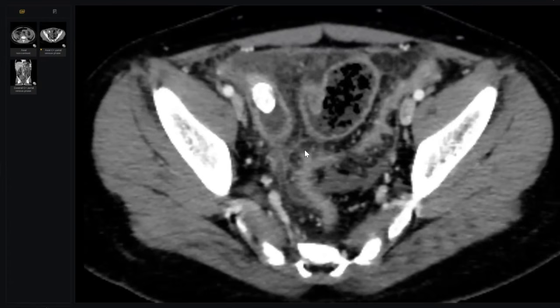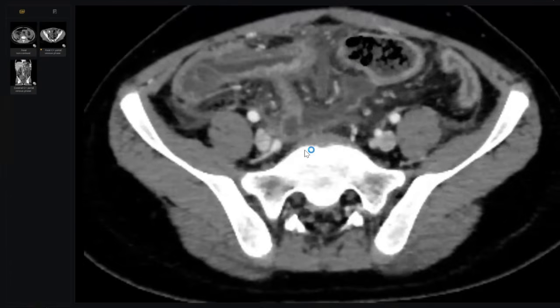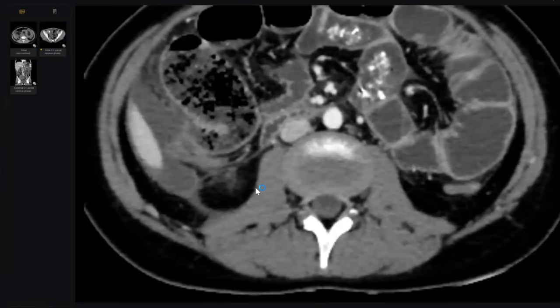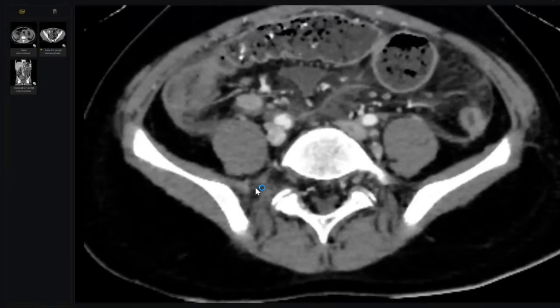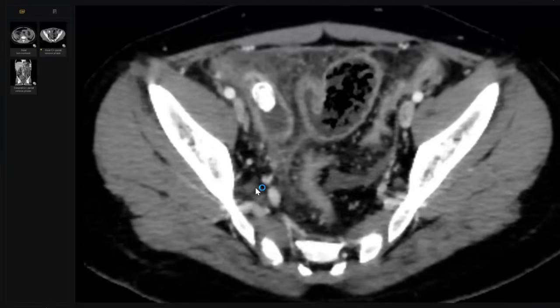And second question, do you think Crohn's disease will cause a fever? And the third point, do you think Crohn's disease will cause this effusion? Sir, it is one of the main differentials. Likely, this is an infective etiology, sir, that is leading to this thickening and small bowel obstruction and narrowing.